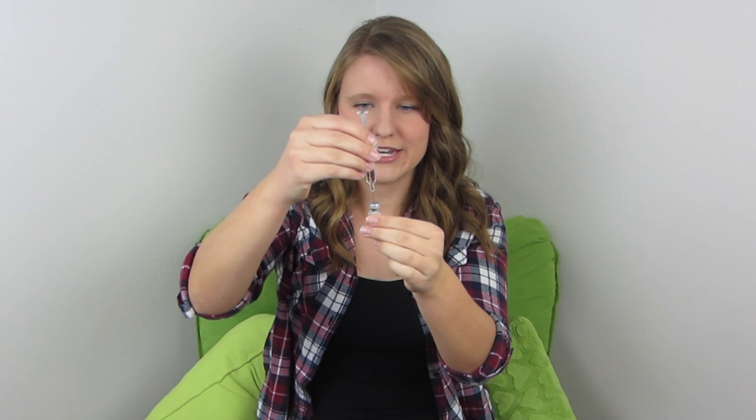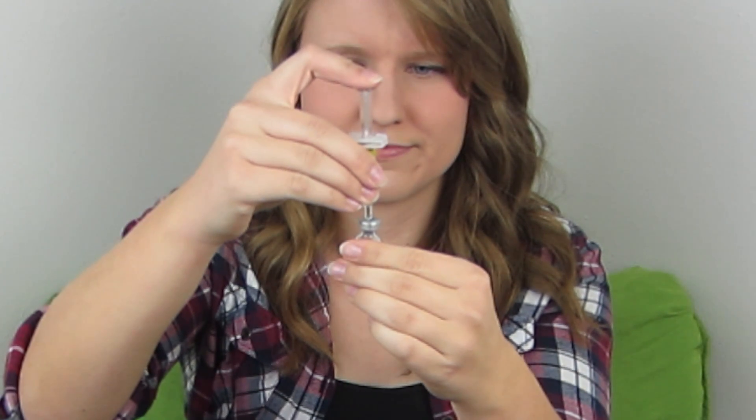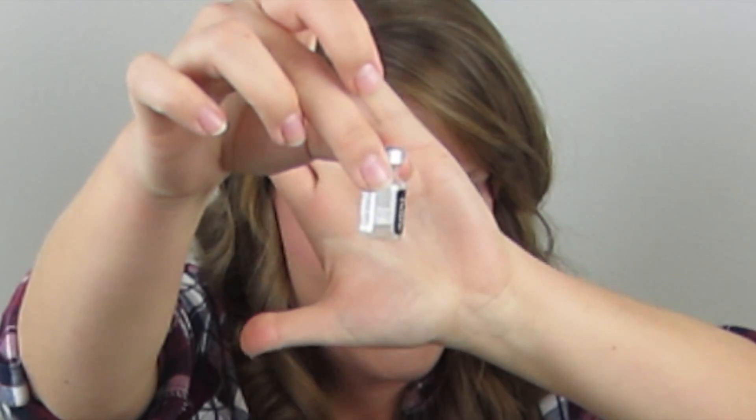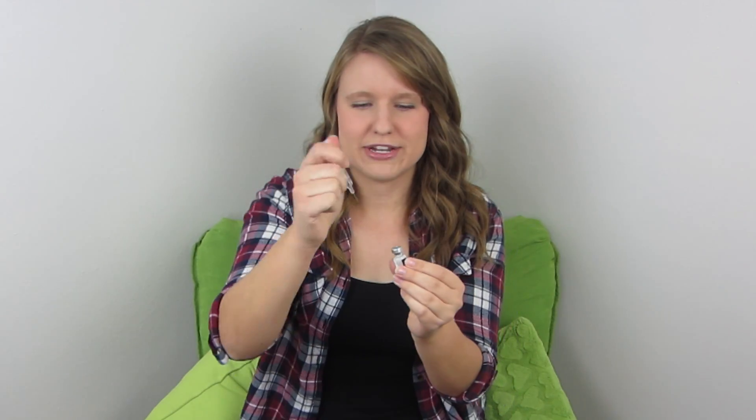First, pop off the top of the powder vial — this is an expired kit so I'm not wasting it. Then get your syringe and pop off the top so you can see the needle. Inject all that fluid into the vial and you'll see it dissolve the powder. Swirl it around so that it dissolves completely, then take that same needle, put it right back in the vial, and draw it all back up.